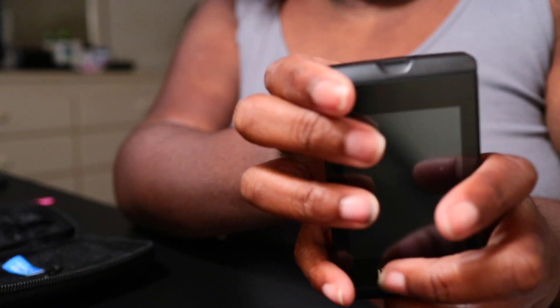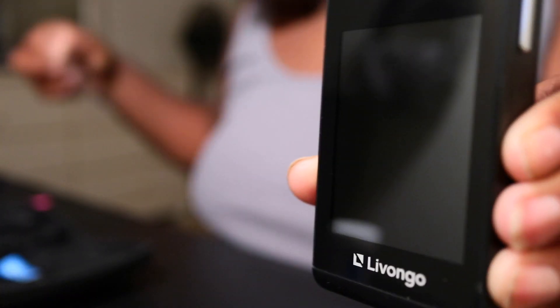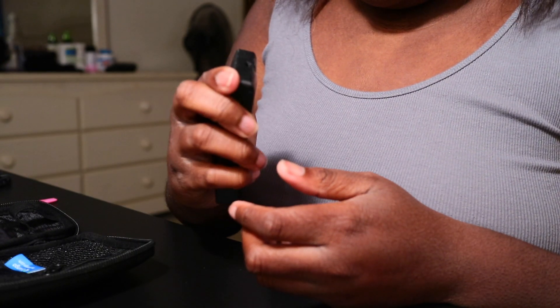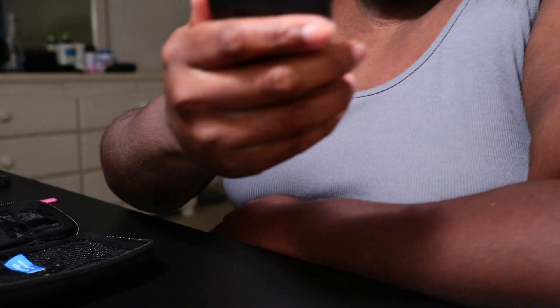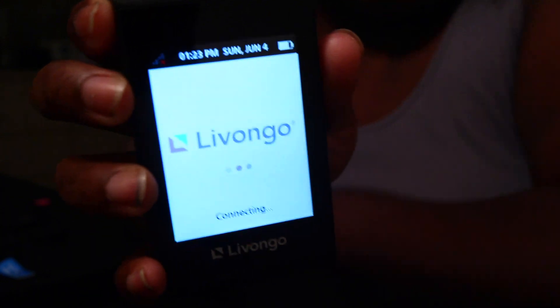I know everybody likes when you peel off the plastic. So let's see if we can turn it on — it beeped and it turned on. It looks like this when it first turns on. It's got to connect to my phone, so I'll show you guys that — I'll be right back.